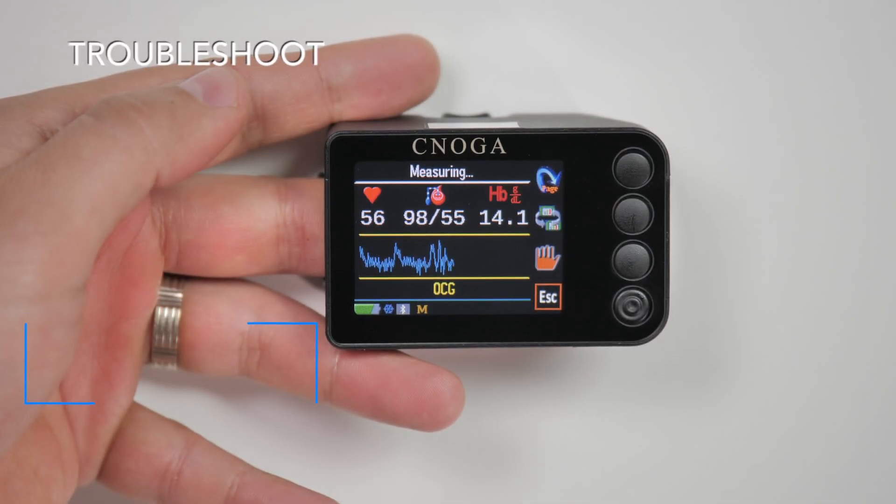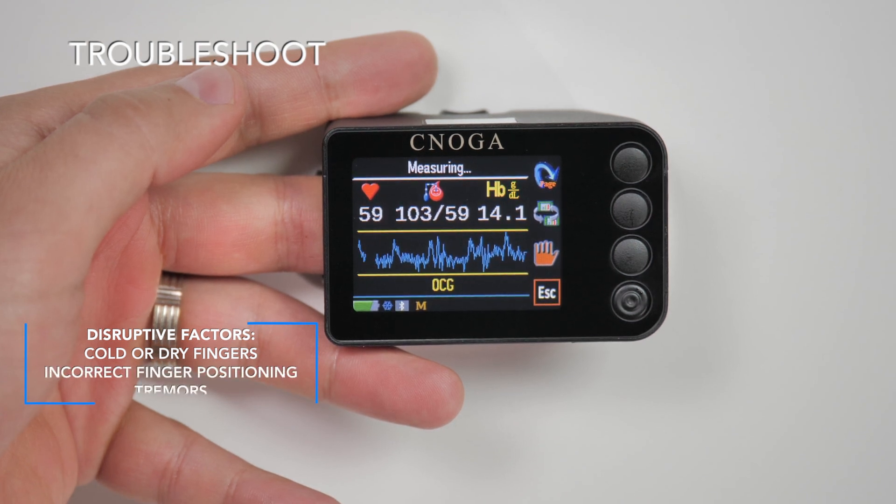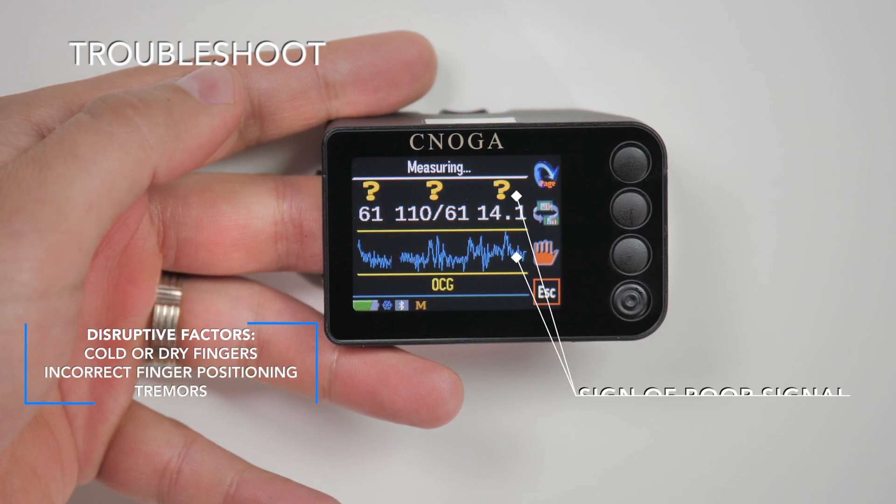If a question mark blinks above the parameters or a noisy waveform is displayed, withdraw your finger from the chamber, reinsert it, and start the measurement again.